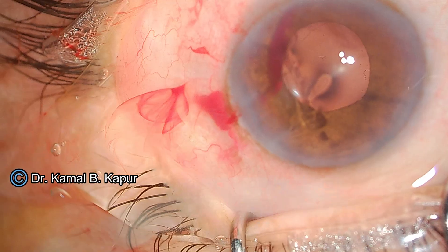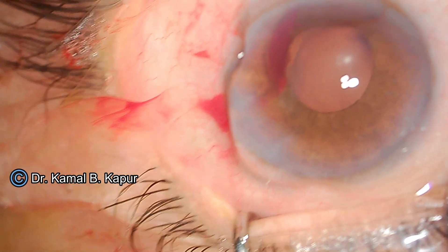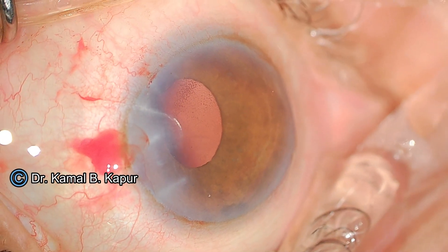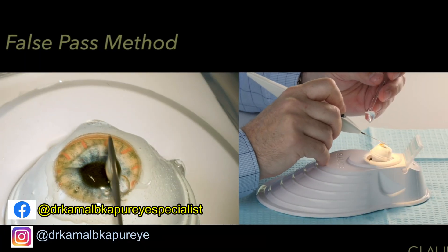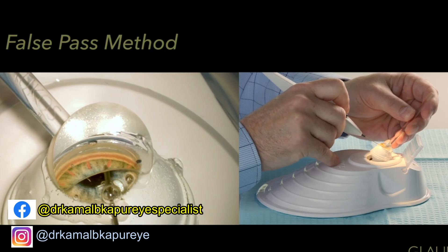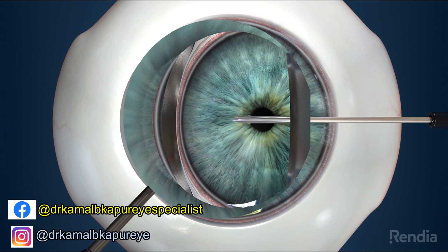We inject some viscoelastic to flush out the oozing blood. Once the oozing blood has been cleaned, we coat the cornea with viscoelastic again and proceed to reinsert the stent. The prism lens is placed again onto the cornea. A false pass occurs when the angle of entry of the injector piston is tilted, which can result in locking or incomplete release of the stent and cause wrong loading in the trabecular meshwork.